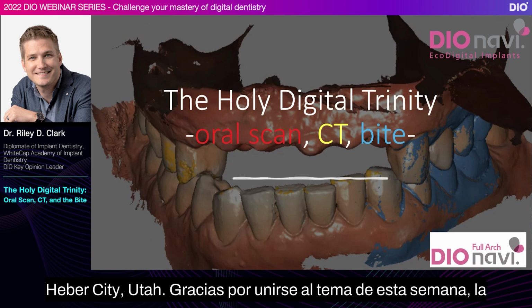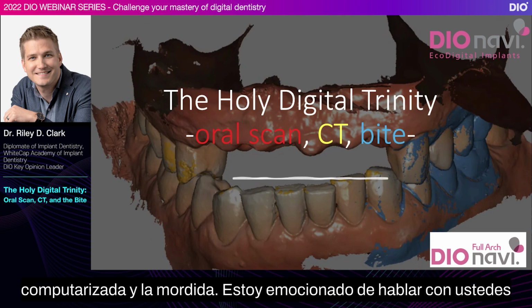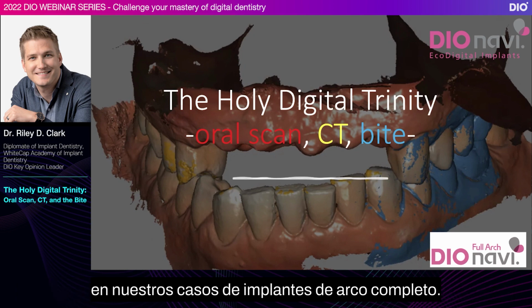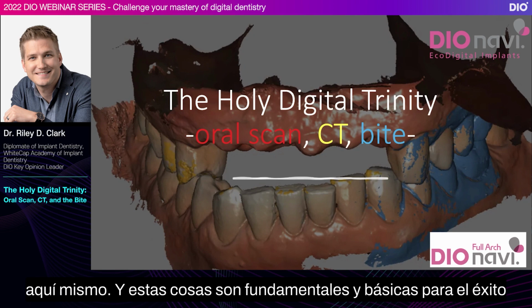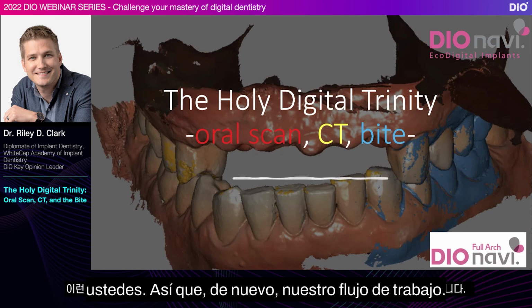Thank you for joining in on this week's topic, the Holy Digital Trinity: oral scan, CT, and bite. I'm excited to talk to you guys about these diagnostic processes that are most important for us being successful with our implant cases, with a special focus on our full arch implant cases. If you are getting into this workflow or wanting to get into it, it all begins with this lecture right here. These things are fundamental and basic to the success of our cases, and I'm excited to share all this with you.